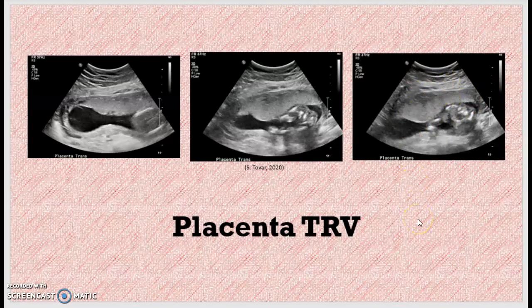And then for these, like I said, you probably could get it all in one image, but you want to just go ahead and make sure that you're getting each section, and you want it to fill up your screen pretty well. Like, you don't want this to be way over here in this area and then have it fill up the rest of the screen this way. You just want to make sure you have it filled all the way, and just make sure that you're checking for any abnormalities that can be present. So that's why it's really important to make sure that you image each section this way versus just trying to get it all in one full image.